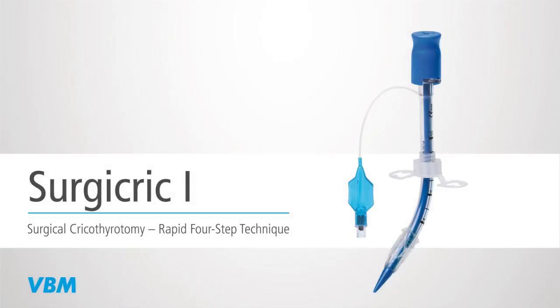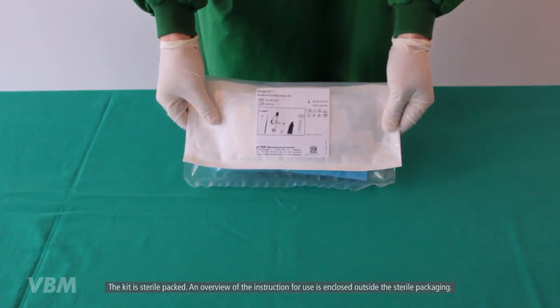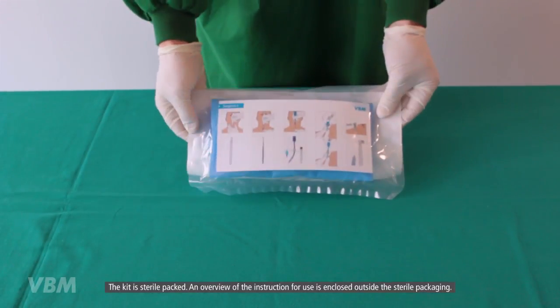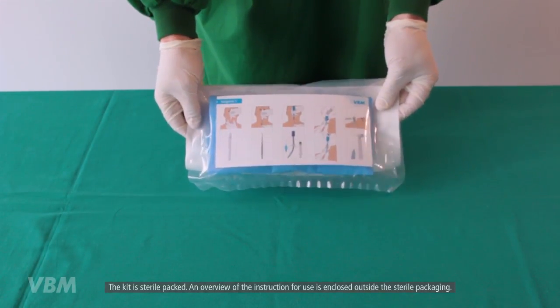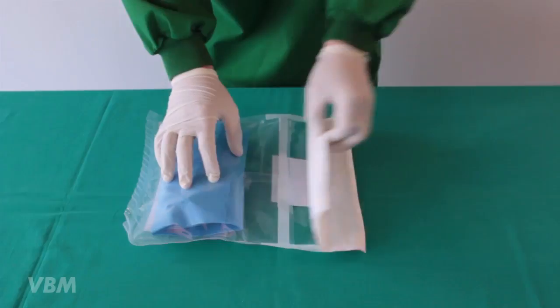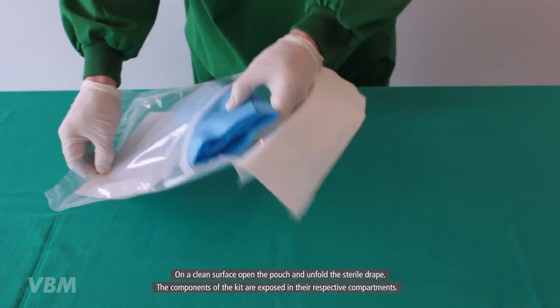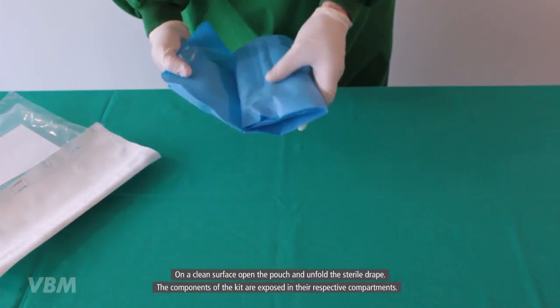The following video describes the insertion technique of the VBM cricothyrotomy kit, called the Surgicric I, according to the rapid four-step technique. The kit is sterile packed and an overview of the instructions for use is enclosed outside the sterile packaging. On a clean surface, open the pouch and unfold the sterile drape so the components of the kit are exposed.